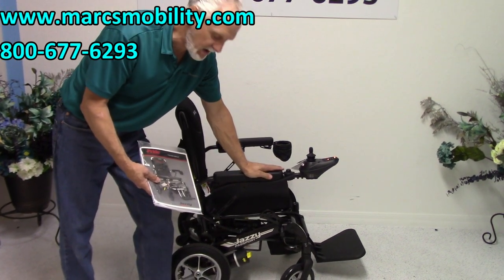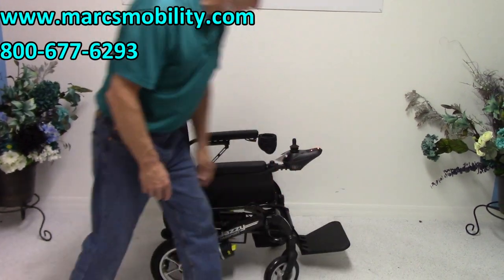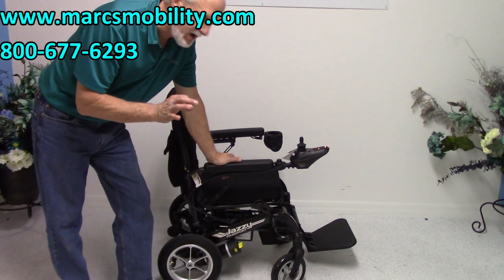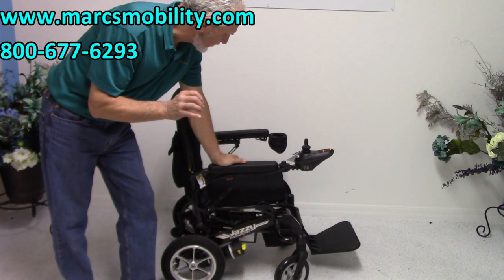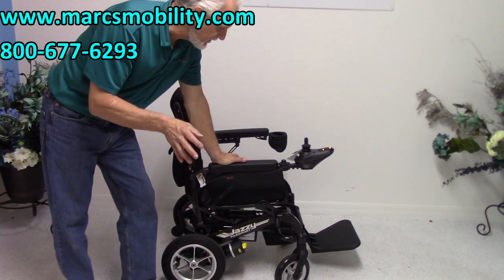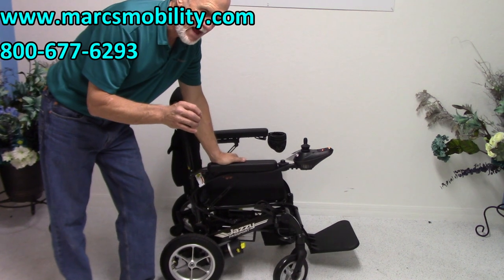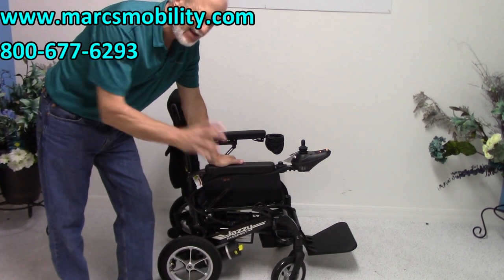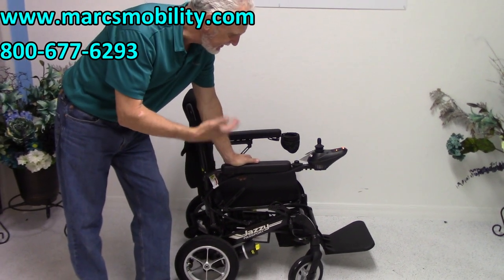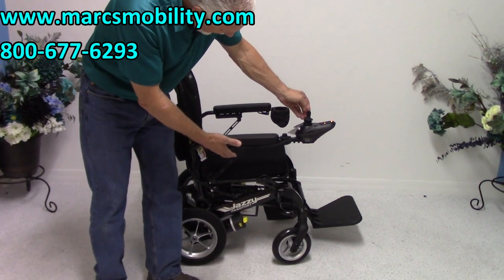This is a portable power chair — specifically, a portable folding power chair with lithium batteries. So if you travel with this power chair, the chair weighs 54 pounds without the battery pack and 61 pounds with the battery pack inside. It has a beautiful slim design.